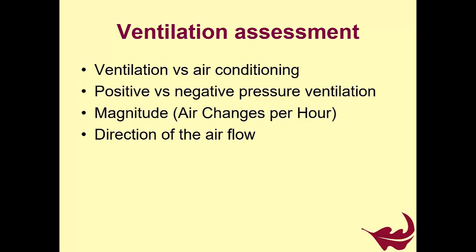When it comes to infection control here, we're talking about TB, and as an aerosol producing procedure, spirometry, we want ventilation and not just air conditioning. Also, we need to distinguish between positive and negative pressure ventilation, so whether you're sucking or blowing, and then how much, so the number of air changes per hour. But many people have negative pressure ventilation and sufficient air changes per hour, but they never look at the direction of airflow, and that might still cause a risk.